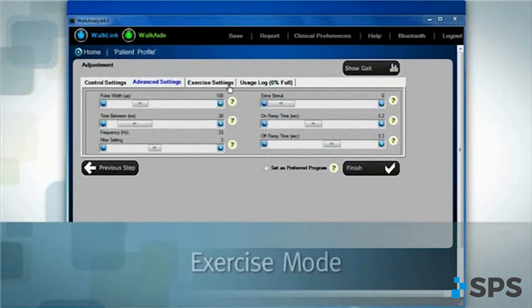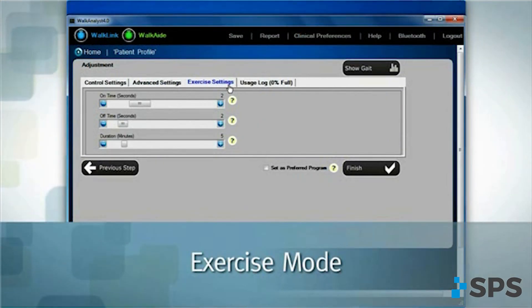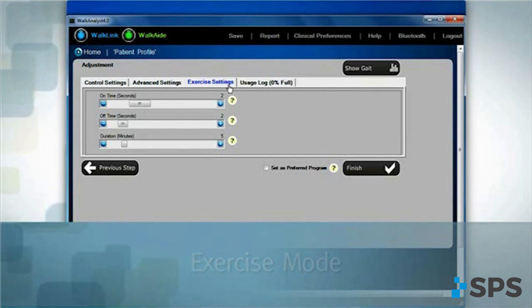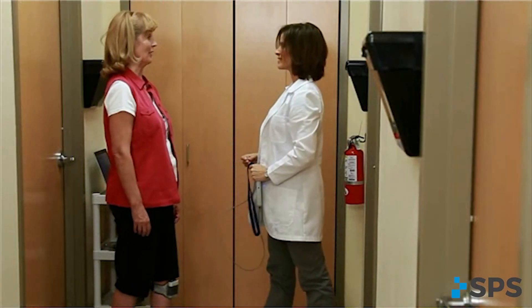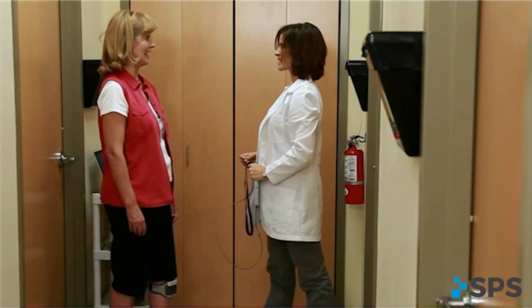Select the exercise mode tab to customize an exercise program for your patient. Any time you adjust the walking program, observe the patient walking again. The patient is ready to enjoy the benefits of WalkAid.